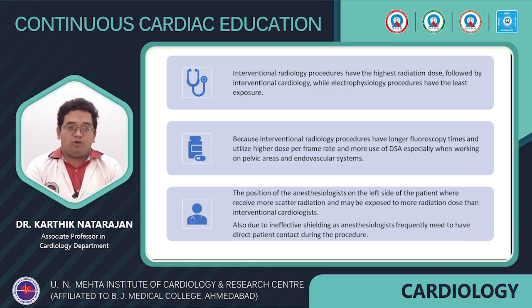Now, interventional radiologists have the highest radiation dose, followed by interventional cardiologists, whereas EPs have the least exposure. And that is because interventional radiology have longer fluoro times and utilize high dose per frame rate and more use of DSA, especially when working with pelvic or endovascular systems.